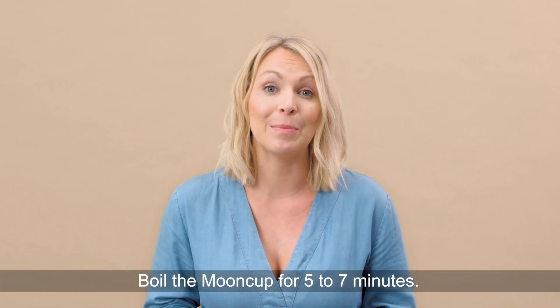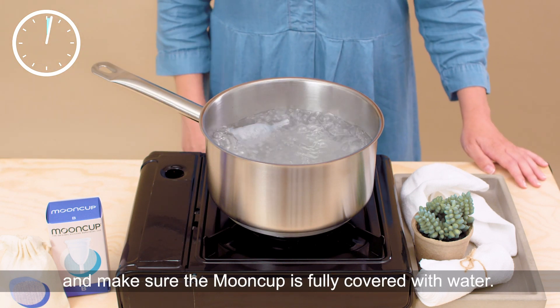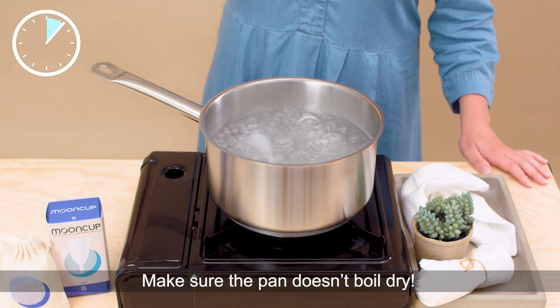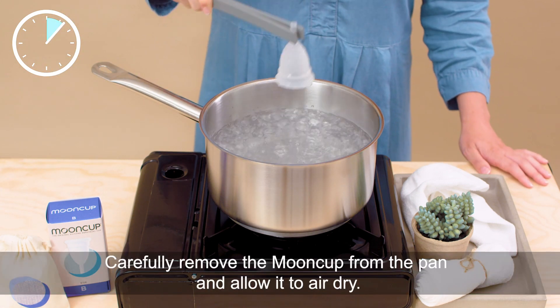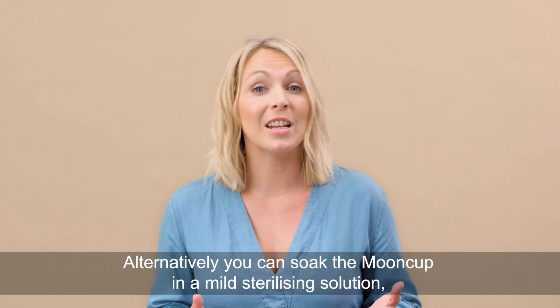Boil the mooncup for five to seven minutes. Use a clean pan set aside only for this and make sure the mooncup is fully covered with water. Make sure the pan doesn't boil dry. Carefully remove the mooncup from the pan and allow to air dry.